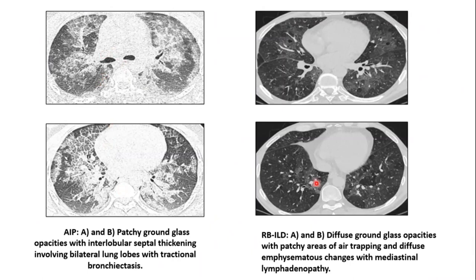The next is respiratory bronchiolitis-associated interstitial lung disease. This disease is mainly associated with smokers, and it is characterized by macrophage accumulation within the bronchiolar and alveolar wall. On HRCT, we can see ground glass opacity and centrilobular nodules. In advanced cases, we can also see fibrotic changes. Other changes related to smoking such as bronchial wall thickening and centrilobular nodules can be seen. In this set of images, we can see the presence of diffuse ground glass opacity with patchy areas of air trapping and diffuse emphysematous changes, with mediastinal lymphadenopathy. This is the case of respiratory bronchiolitis-associated ILD.